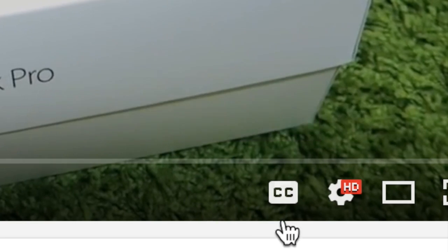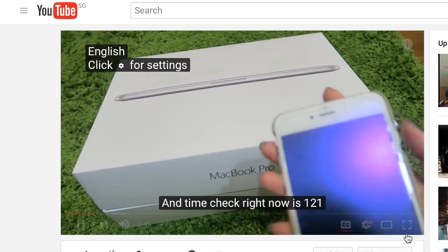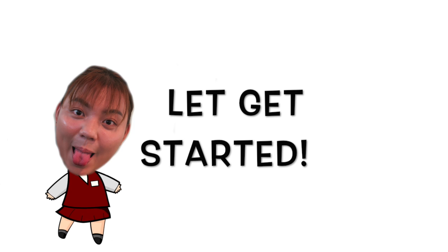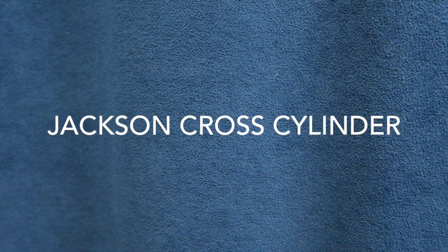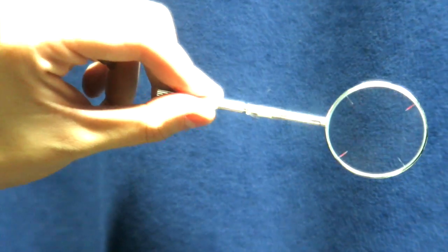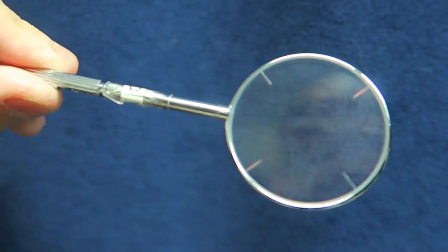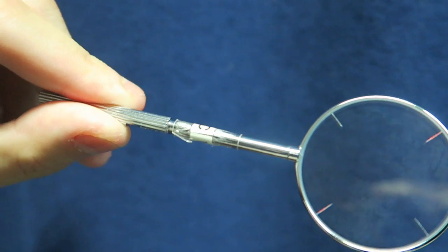For better understanding, remember to turn on CC for subtitles. Without further ado, let's get started. What is JCC? Known as the Jackson Cross Cylinder, it is an instrument used to measure astigmatism. Do take note of the red and black lines on the JCC.